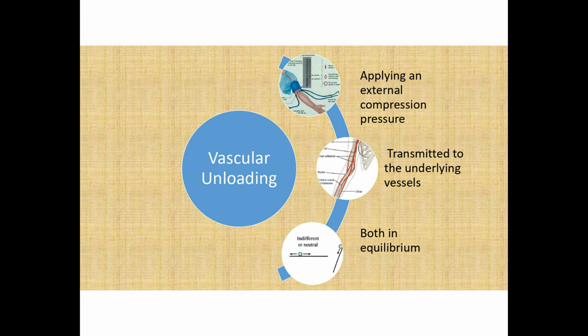Both are at the same pressure. Attaining that equal force, that equilibrium, is called vascular unloading.